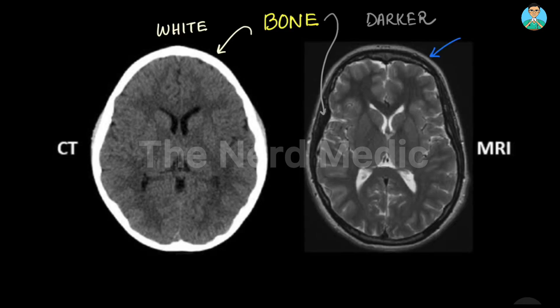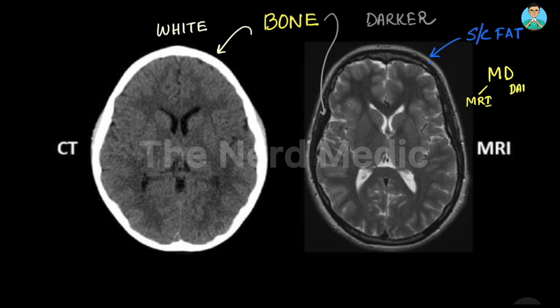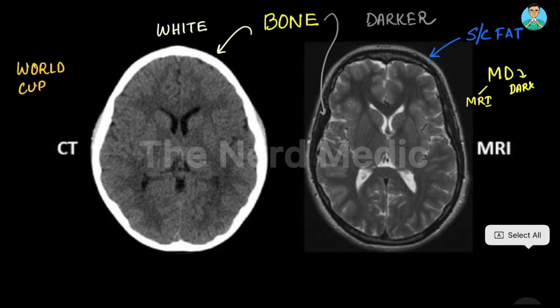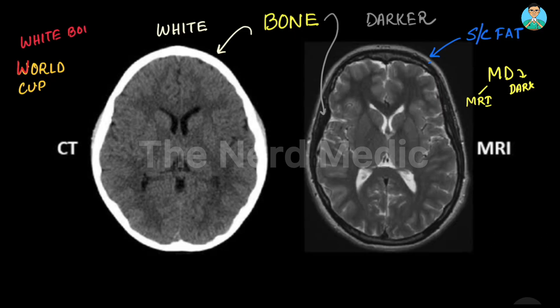This structure that you see over here is the subcutaneous fat of the scalp, and not the bone. One simple trick to remember: 'MD' — in MRI, bone is Dark; and 'World Cup' — where W stands for White bone on CT scan.